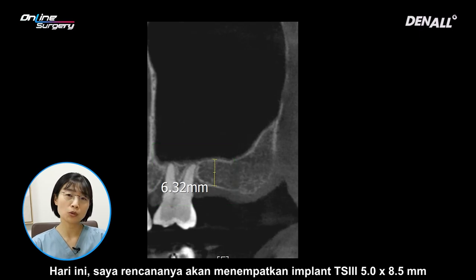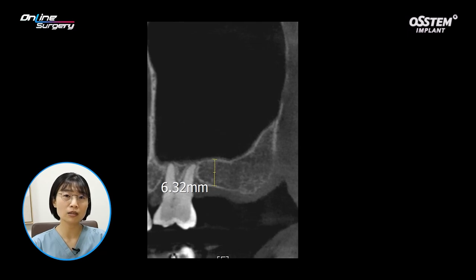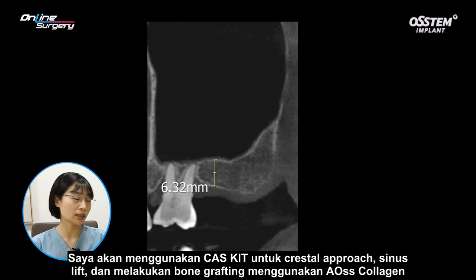Today, I plan to place a TS3 implant, 5.0 by 8.5 millimeter. I'll use CAS kit for a crestal approach, sinus lift, and perform bone grafting using AOss collagen.